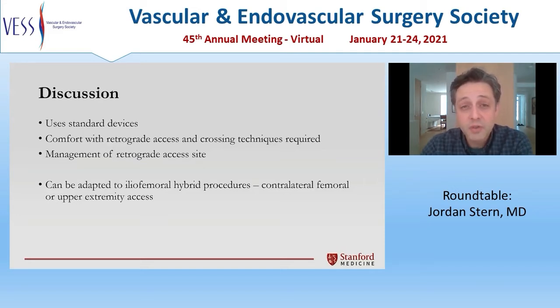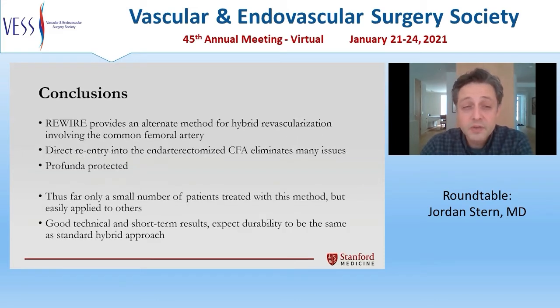The procedure, although generally performed in femoral popliteal revascularizations in this series, could easily be adapted to iliofemoral hybrid procedures with access via the common femoral artery on the contralateral side or via upper extremity access to cross the iliac disease. In conclusion, REWIRE provides an alternate method for hybrid revascularization involving the common femoral artery.